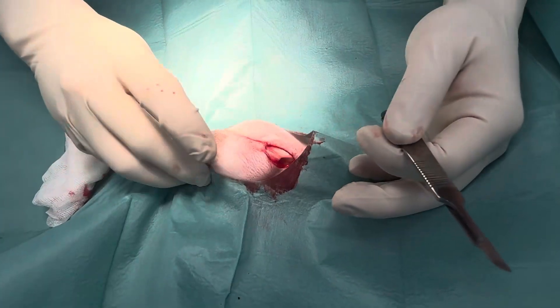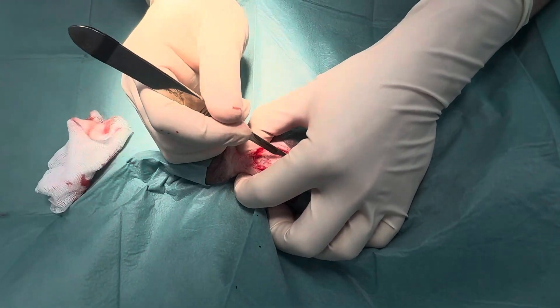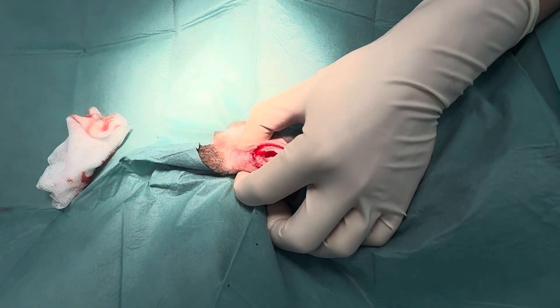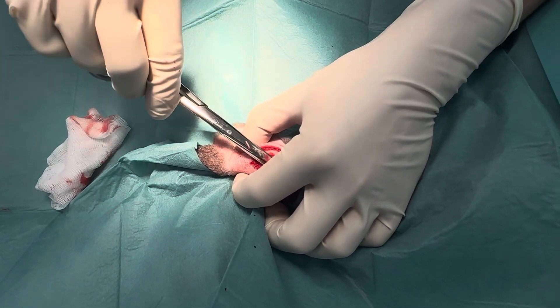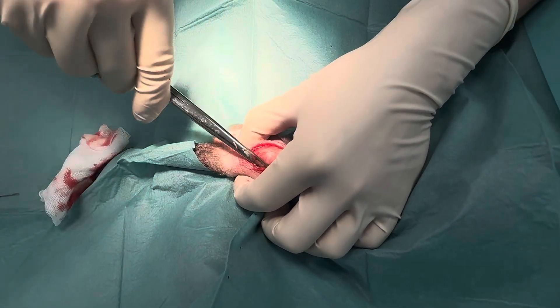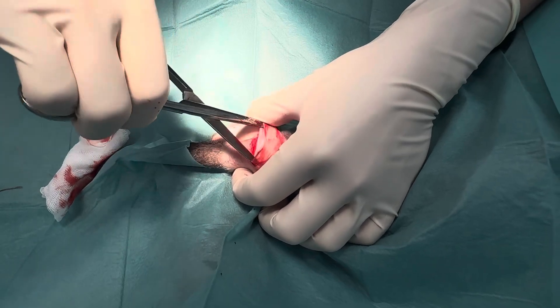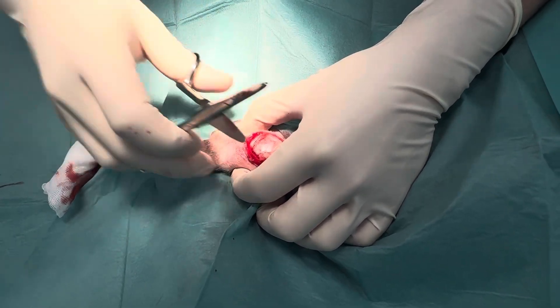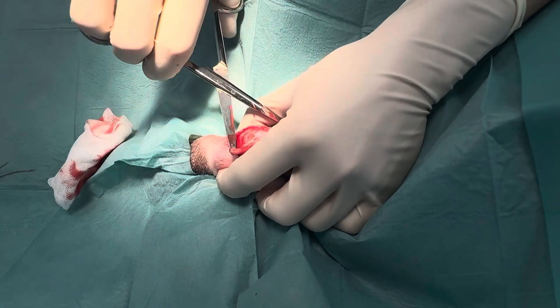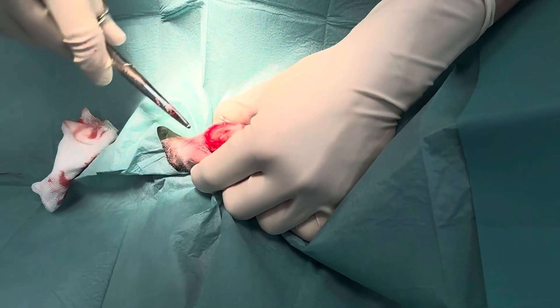So this will be his left testicle. I'm going to push it into the same region, incise over the top very gently. If you go too hard you're going to make it an open castrate, which is not a problem. There's really no real evidence between doing an open or closed castrate. I've not had any issues doing one or the other — in some cases I've done one testicle open, one closed. It's just preference as to what you prefer to do.